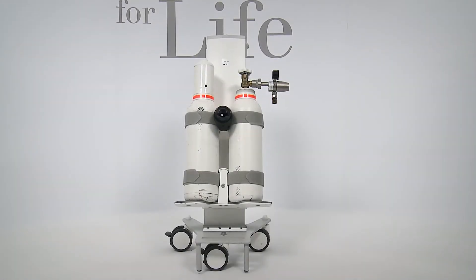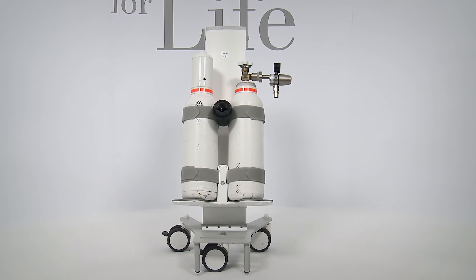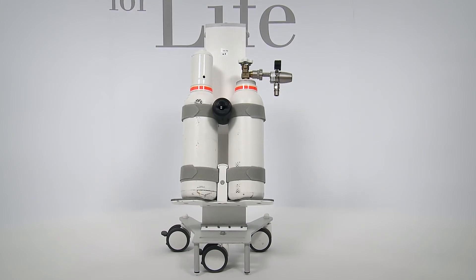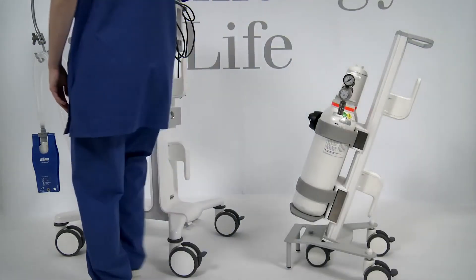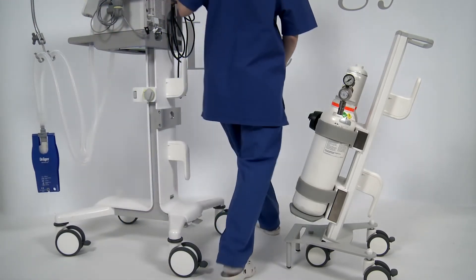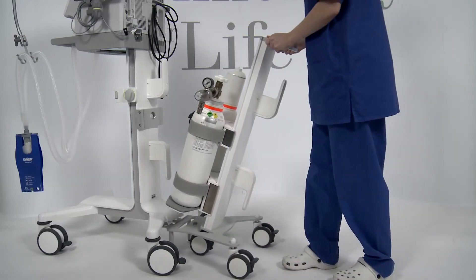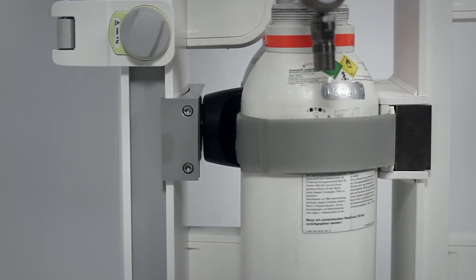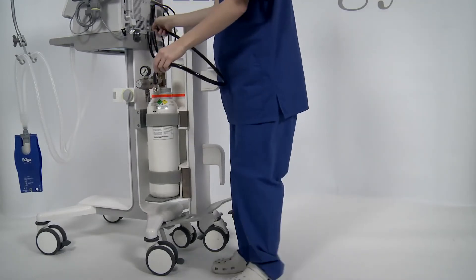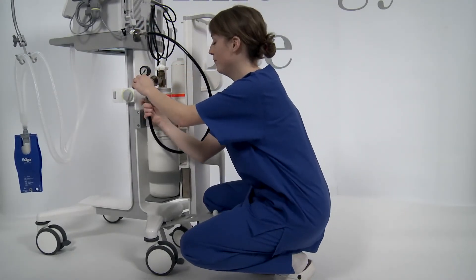The transport supply unit has been designed for a fast coupling to the trolley of the ventilator. It supplies Savina 300 with gas from one or two compressed gas cylinders. To couple the transport supply unit with the ventilator, lock all brakes on the trolley, move the transport supply unit under the trolley, and push the guide pin into the fixing plate. Tip up the transport supply unit until the coupling element audibly clicks into the coupling element of the trolley. Pull on the transport supply unit to check correct coupling. The locking button can no longer be operated when locked correctly.